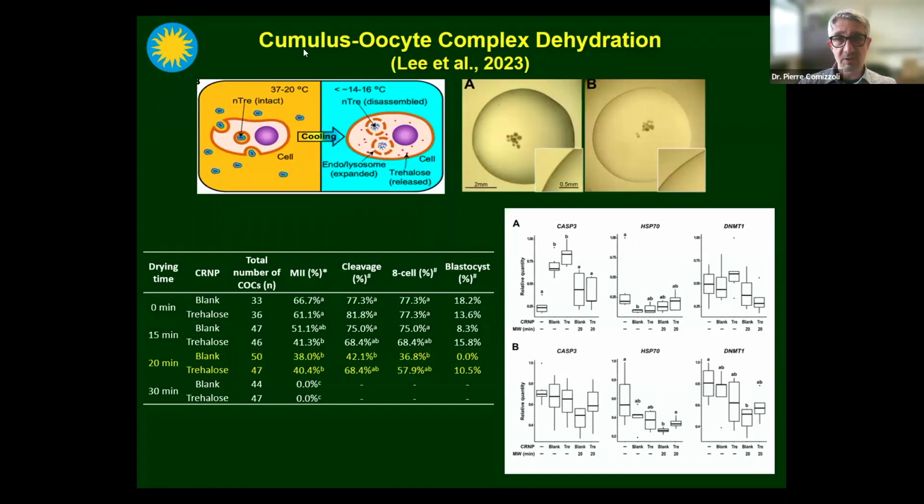And this is what we've been doing recently. My colleague Pei-Chi Lee published this in the Journal of Assisted Reproduction and Genetics not that long ago. But in that case, instead of poking holes in the membranes of the oocytes to incorporate the trehalose, we used nanoparticles, which is a slower process, but it's also helping us to keep the integrity of the membrane.